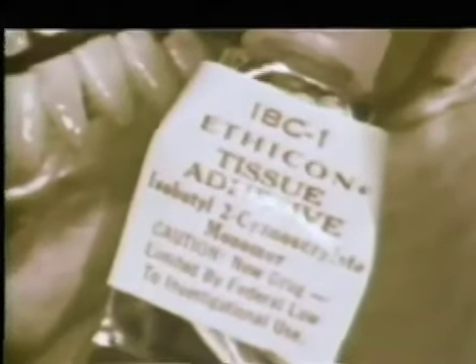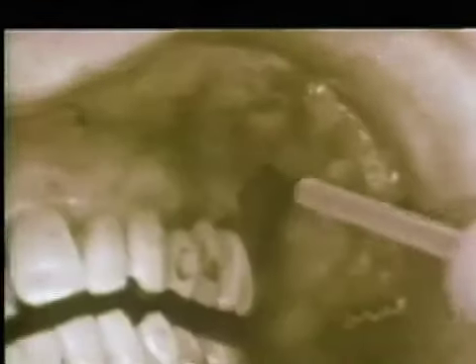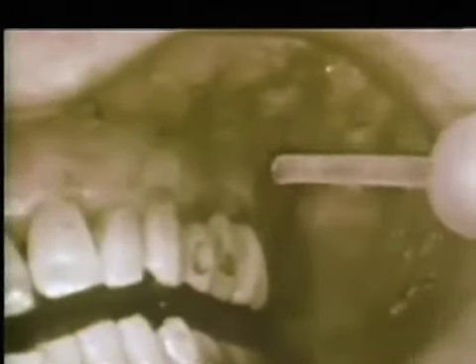The graft is gently held with Alice forceps and detached from the donor site. Care should be taken at this point not to allow the graft to be sucked into the aspirator tip. If any trimming or other preparation of the graft is required, it can be accomplished at this time. The hemostatic agent, isobutyl cyanoacrylate, is placed over the donor site. This reduces any hemorrhage which might interfere with the procedure.